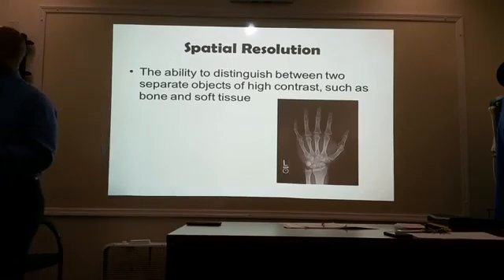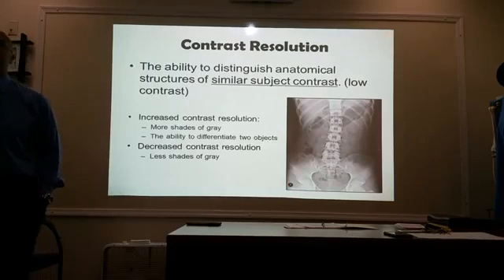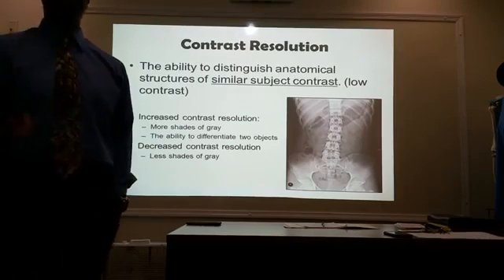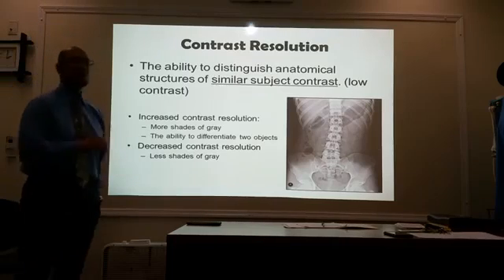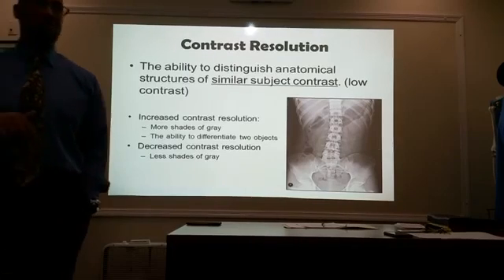The next one is delineating structures that are very similar. This is your contrast resolution: the ability to distinguish anatomical structures that are very similar.